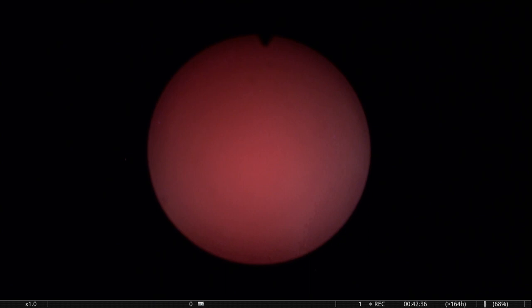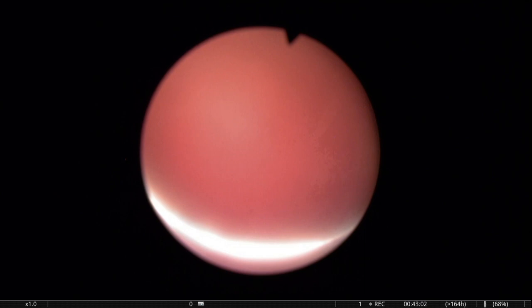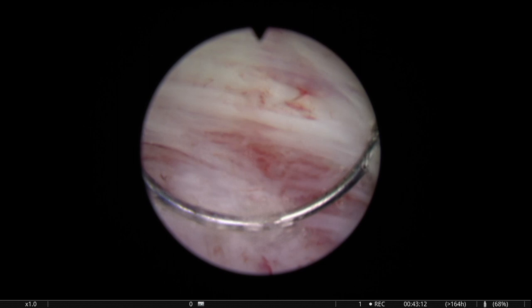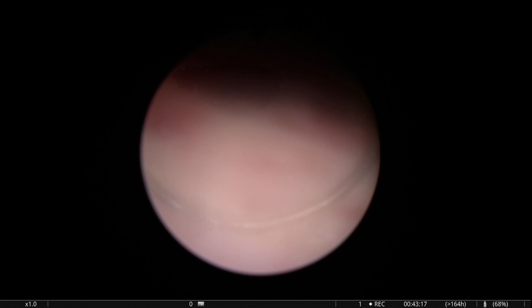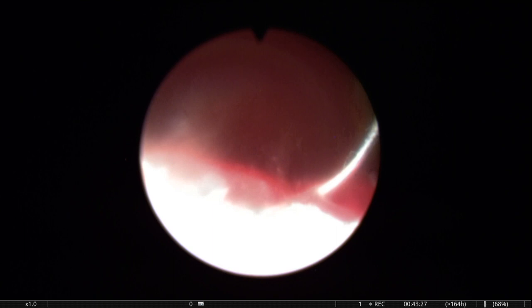In Bulgaria, it's a poor country, and the irrigation bags are very expensive. So we try to make sure as much as possible that the patients will not really need a lot of irrigation postoperatively, because that is quite expensive, and we have to be very careful. I am much more liberal, let's say, to use the resectoscope at the end of the procedure to check if there's any mucosal bleeding. This is the most typical bleeding postoperatively, the mucosal edge. The explosive nature of HoLEP sometimes makes the mucosal incision a little bit rough. The same way, when we cut the mucosa at the apex, we get bleeders. When we cut the mucosa at the bladder neck, we get bleeders also.